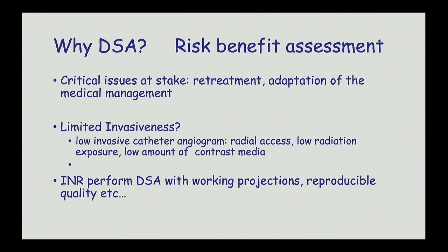We can go through radial. Sometimes we do control with radial, and the patient, after 3 hours, is able to walk. There is less complication. We use very minimal radiation exposure for the patient and a very low amount of contrast media. And I think it's interesting to do DSA because usually you perform the procedure, so you know what the working projection is, you understand well what is going on, and you can work on this.